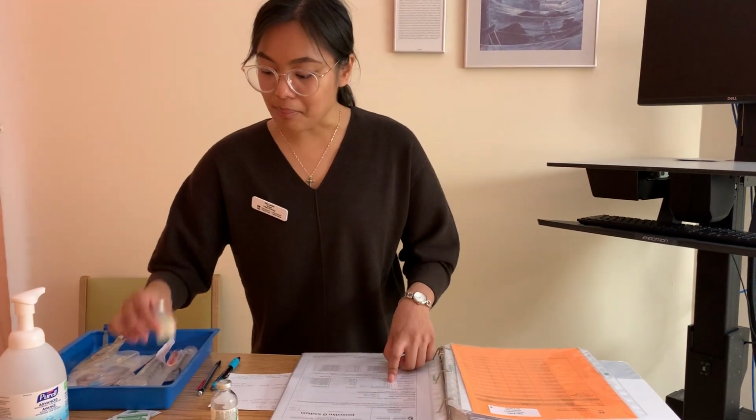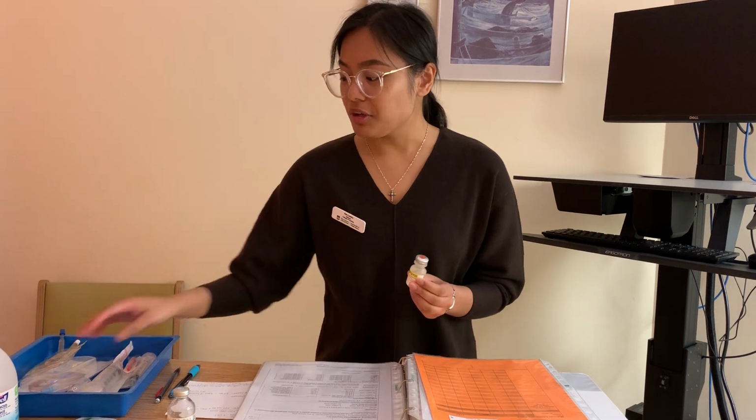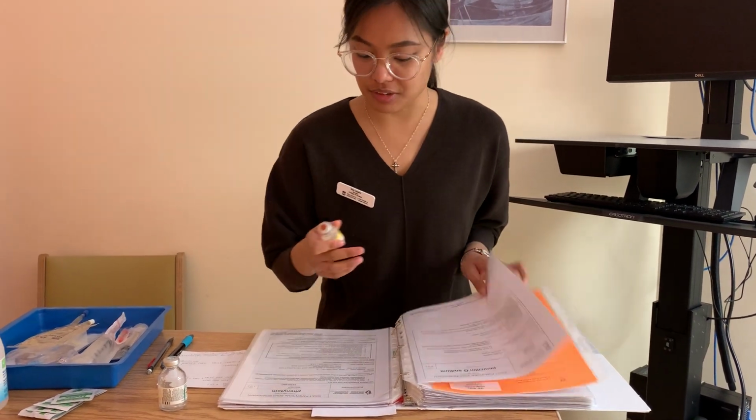Now I already prepared my normal saline. I use normal saline because the CIVA pump was already regulating with normal saline, so normal saline is compatible with normal saline. I'm also going to use a normal saline bag later on, so I will indicate that later on. If I check compatibility here as well, it's compatible with normal saline, D5W, dextrose saline, so that's good with that.